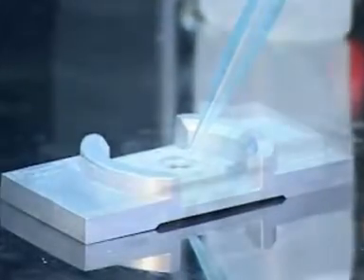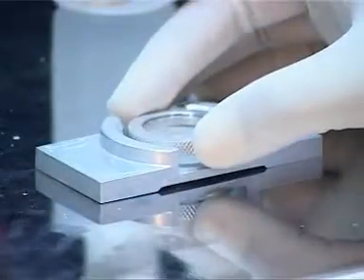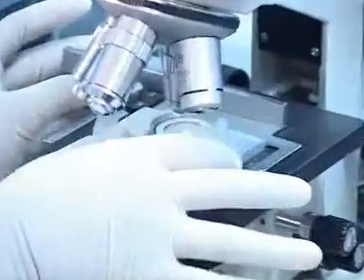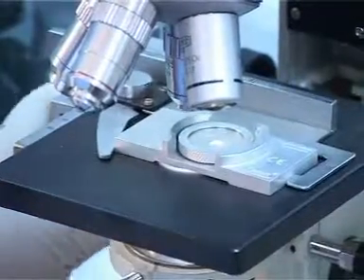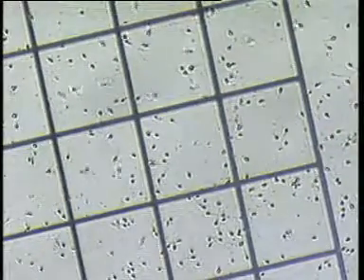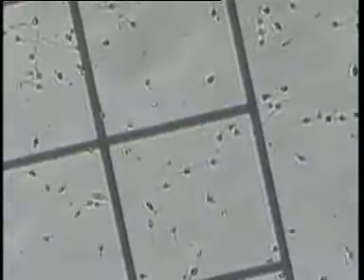Perform pre-wash semen analysis using a sperm meter. Note down sperm concentration, motility percentage, pattern, pus cells, and round cells. Calculate total motility sperm in the given ejaculate.